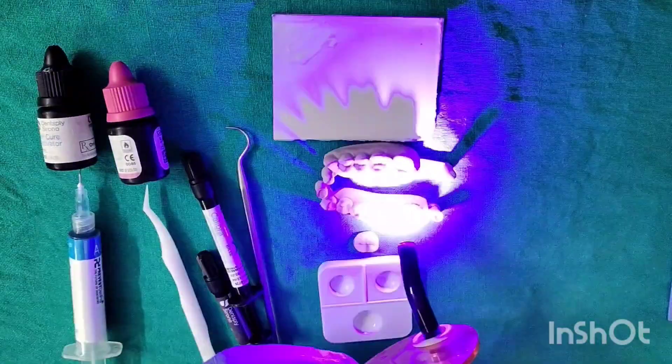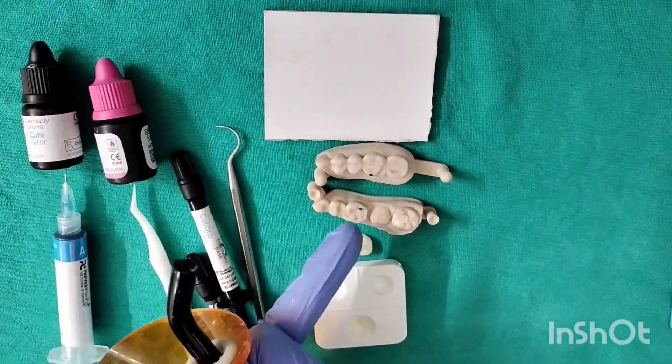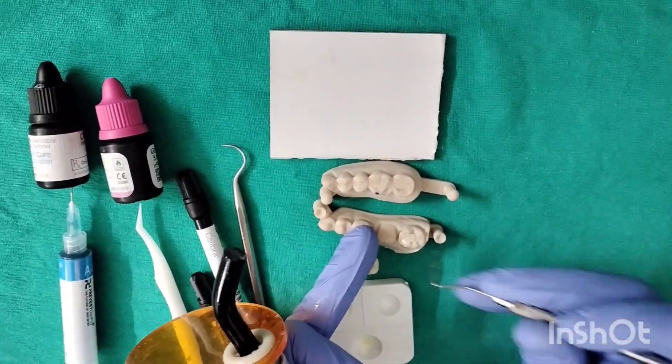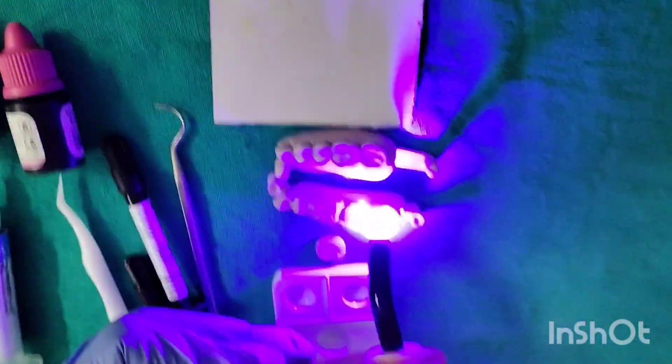Cure it briefly for two seconds, then remove any excess cement on the contours. Wherever you find excess cement, just remove it. Once you have done that, cure evenly from all the surfaces around the inlay.